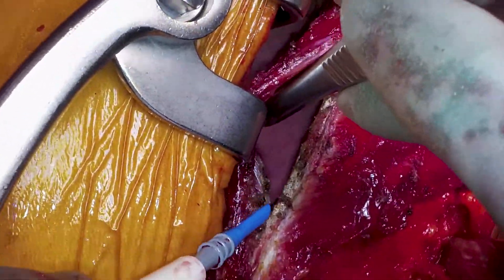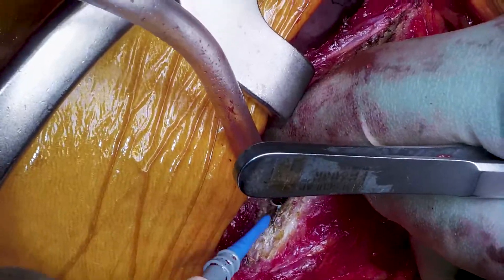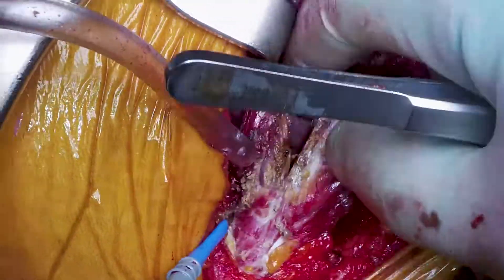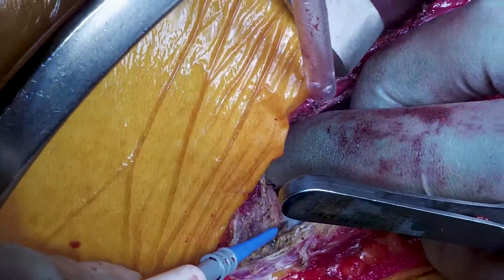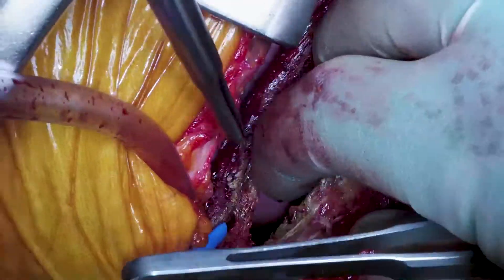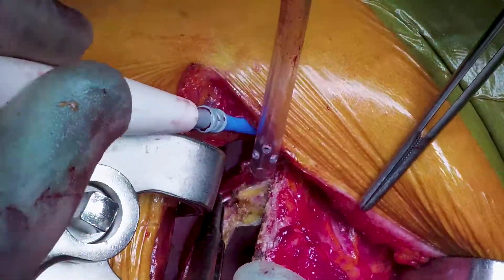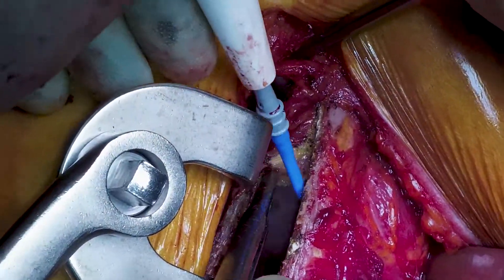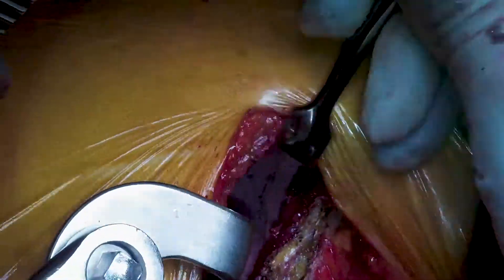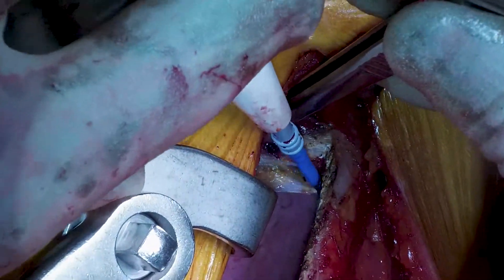When inserting the Rouxcel retractor, we initially place it only on the underside of the sixth rib, with the contralateral side on soft tissue, and slowly ease it a little at a time to relax the ribs — if you clunk it apart you risk damaging them. One of the best things about this procedure is at closure: you don't need to suture the intercostal strip back; you simply let it hang in the groove of the retractor throughout the entire operation so it's not getting crushed, which is the best way to preserve the nerve. It's also important to dissect the strip as far back posteriorly as possible, since the retractors are placed very far posteriorly — there's no point doing a good job anteriorly when the retractors are crushing the nerve in the posterior aspect.